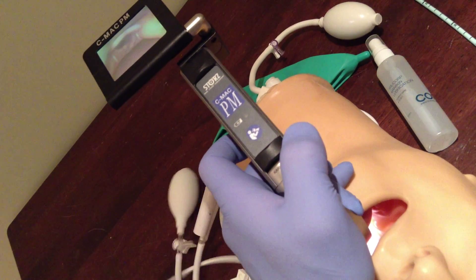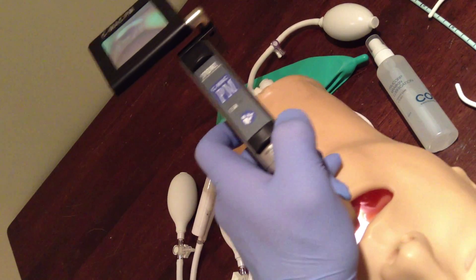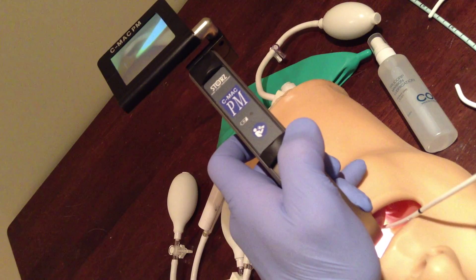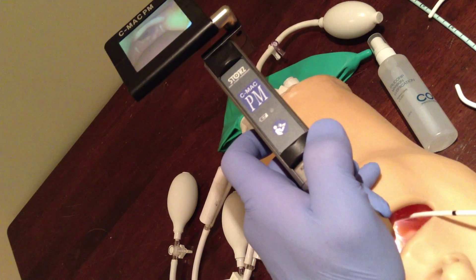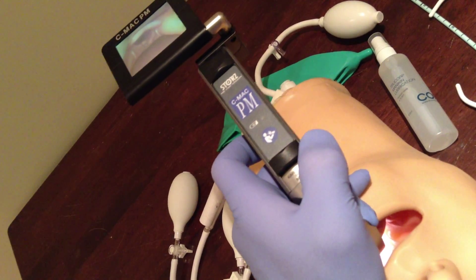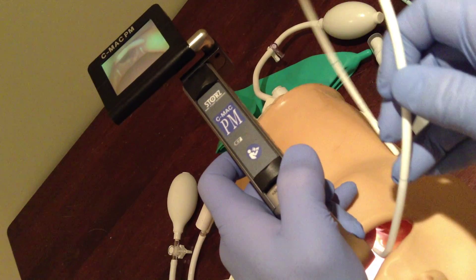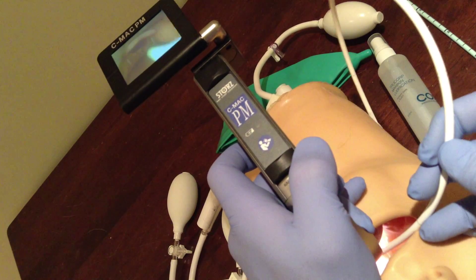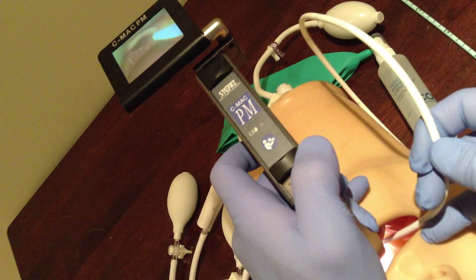Contrast that with the pocket bougie, which has a natural curve. I'll show you the LTA stylet too. It just can't quite make it there, even from a right paraglossal approach — it just doesn't have enough curve. With the pocket bougie, I like to hold it like this. You can see that it's a little bit stiffer, and with a little bit of proximal pressure here, I'm able to actually just lift it up.